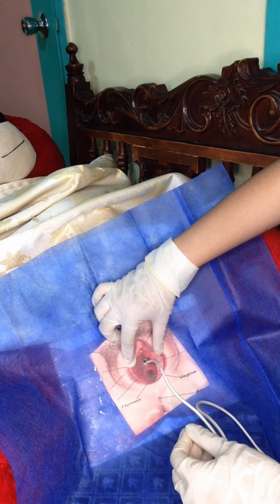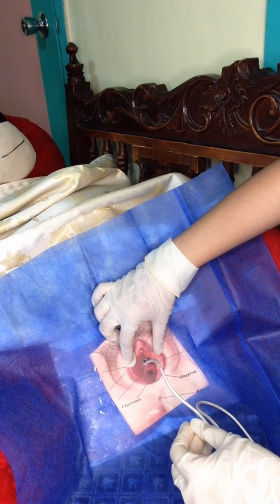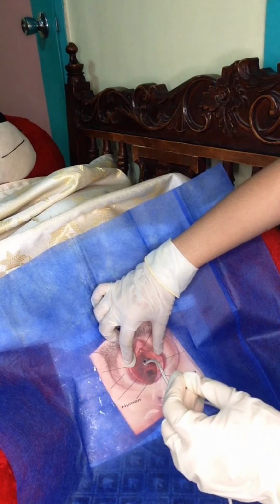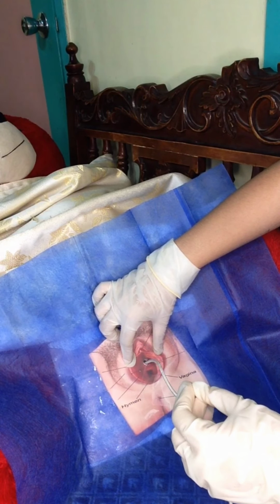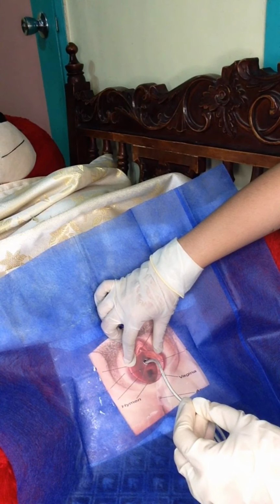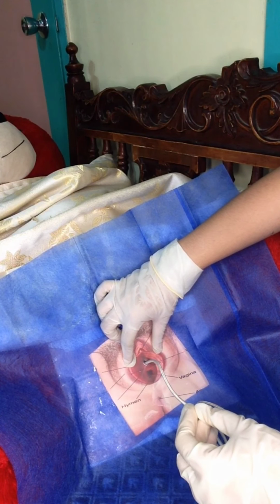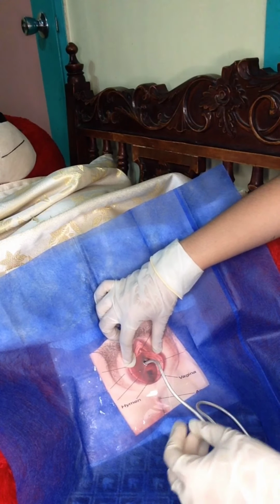If a specimen is to be collected, pinch the catheter with the thumb and the finger while placing the specimen container in position. Rest the hand on the pubis area while holding the catheter in place to prevent pulling and pushing of the catheter. Connect the catheter to the urine bag. Inflate the balloon with the use of a 10 cc syringe with sterile water.